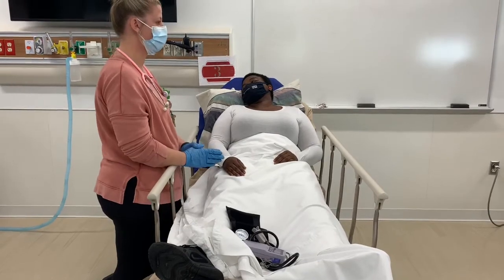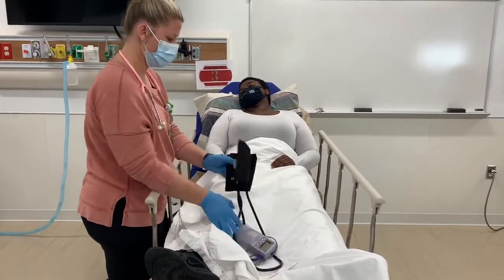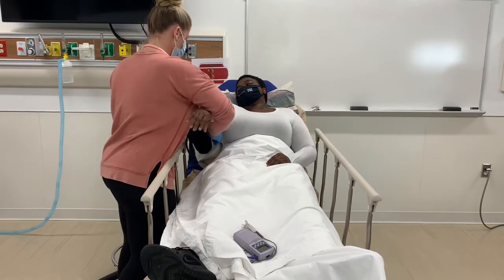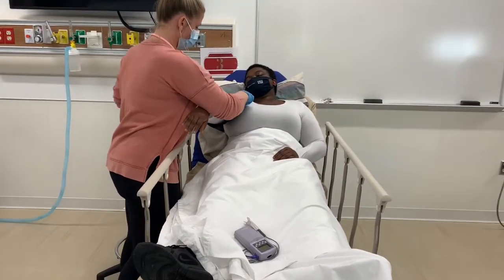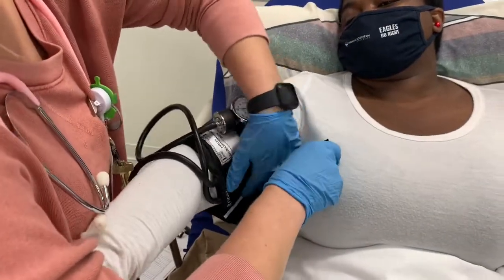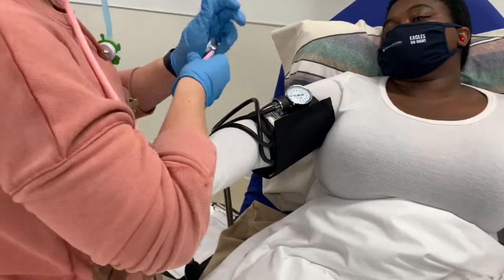Now you'll move on to blood pressure. Locate the brachial pulse. Miss Eddie, I'm gonna take your blood pressure, okay? Correctly size the blood pressure cuff. Apply the cuff correctly. Make sure the brachial artery is over the artery line. And remember, if you can't locate the brachial pulse with your stethoscope, to not waste a lot of time on that and move on.